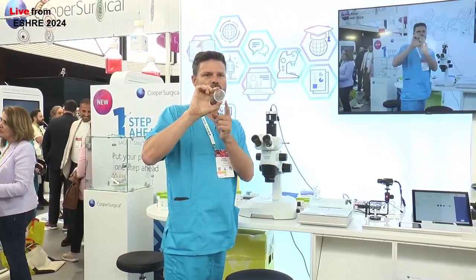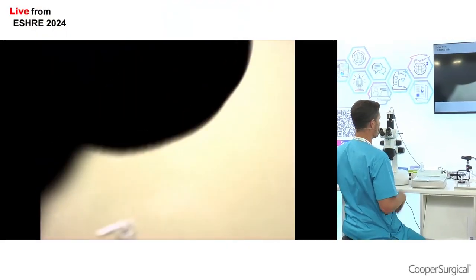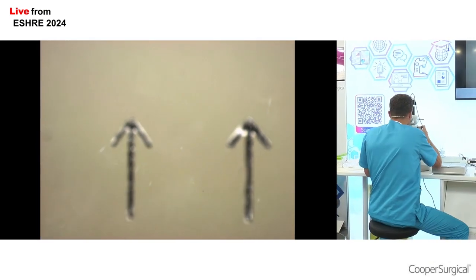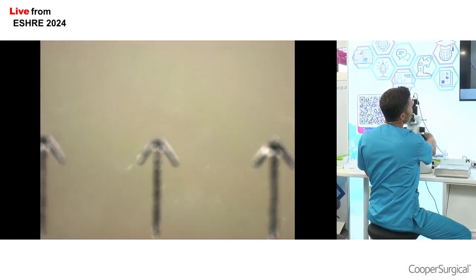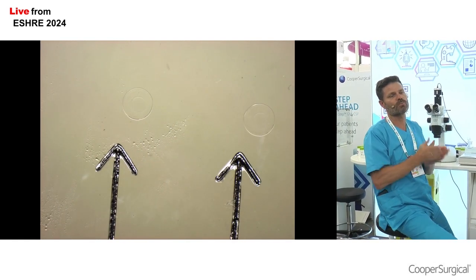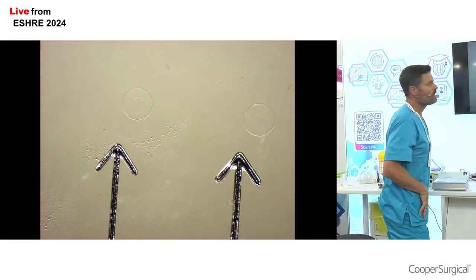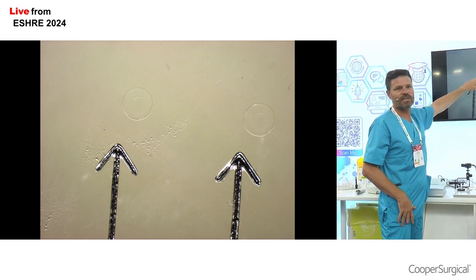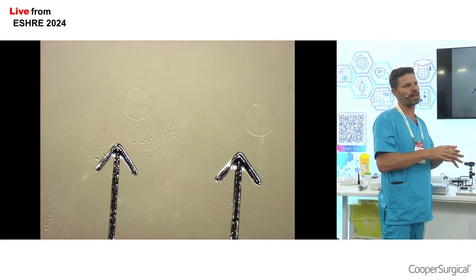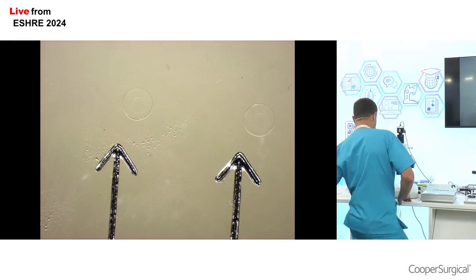What you probably can't see from where you are is that there are 3 small arrows on the dish. I'm going to show you on the screen. Now you can look at all 3 screens if you can't see this one. You see the three arrows, okay? What those arrows are indicating to me is at the end of each arrow there's a small drop of hyaluronic acid. And you can see this is the drop of hyaluronic acid there. So what I'm going to do is place my prepared sperm for the ICSI over that hyaluronic acid, and that's where we're going to select the sperm which are binding to the hyaluronic acid. I'll show you the process of that now.